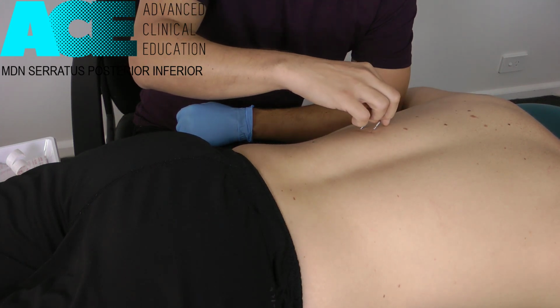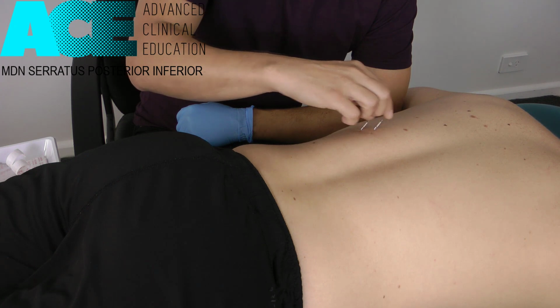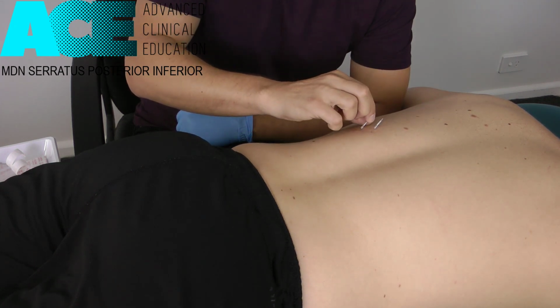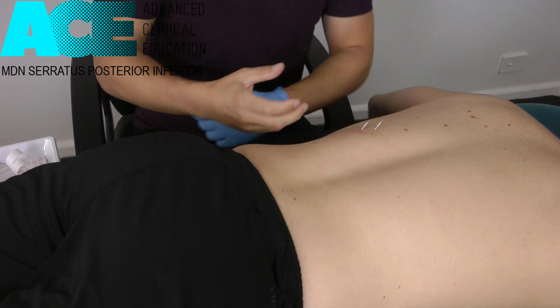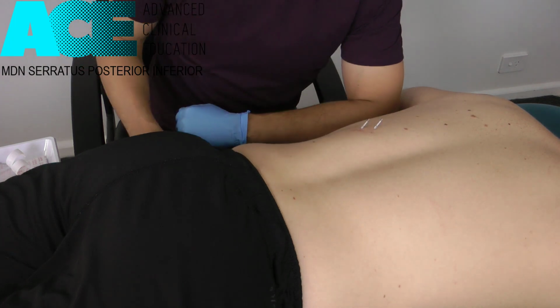You can see a little twitch there from the muscle. We can wind up that tissue, and typically if that muscle's tight, the patient will respond by experiencing quite a bit of tension build up in that area. It's a great way to get a little myofascial stretch in the tissue, but also possibly hit some trigger points in the process and decrease the tension on that Serratus Posterior Inferior.